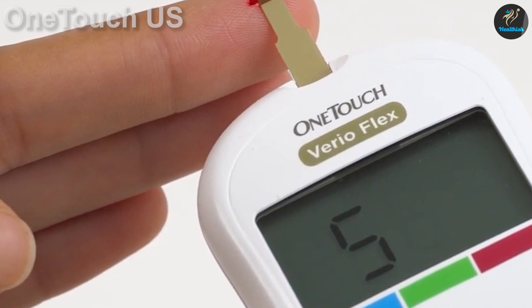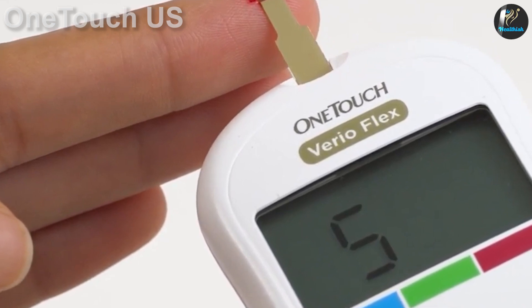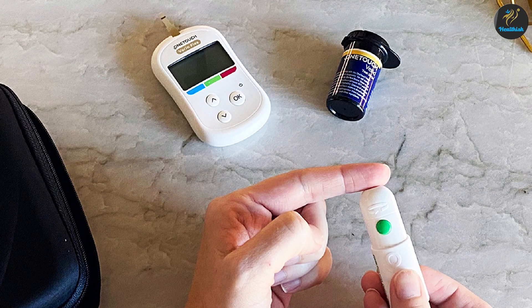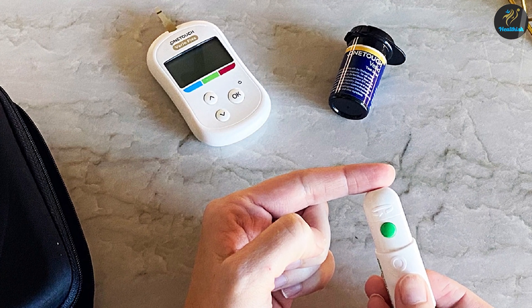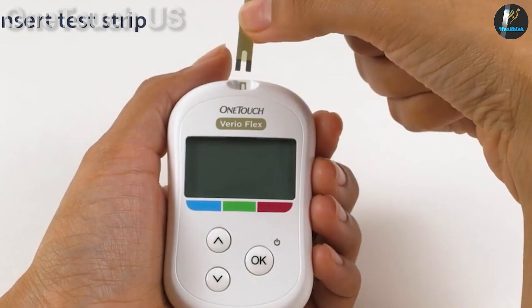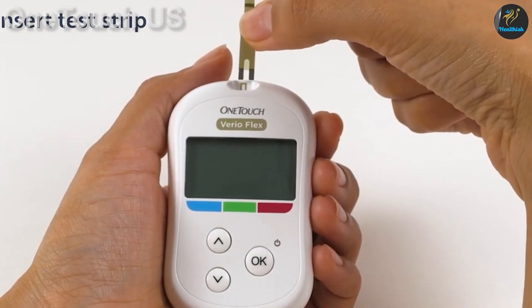Users of older Verio models will notice the lack of backlight, port light, and instant averages, which could annoy some. But for those that value battery life over anything else, these are good changes. In fact, it's the battery life that puts the Verio Flex among our picks of the best glucose meters.